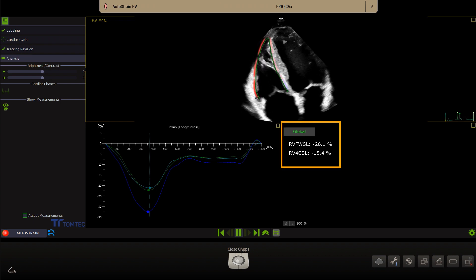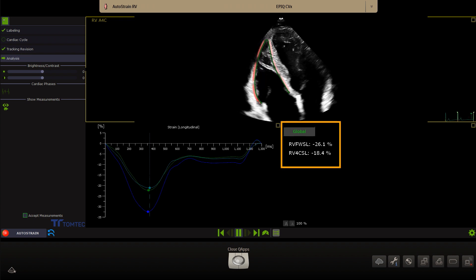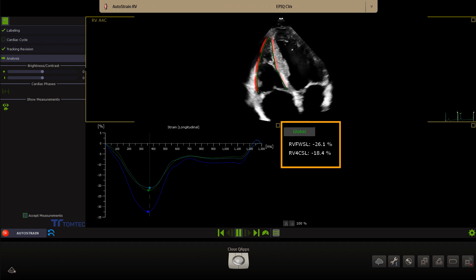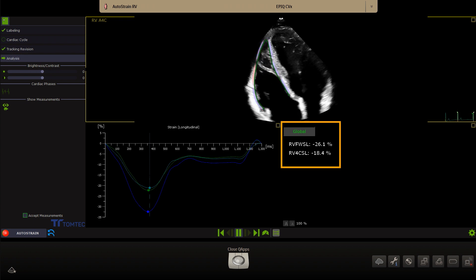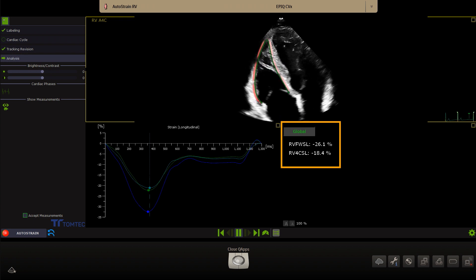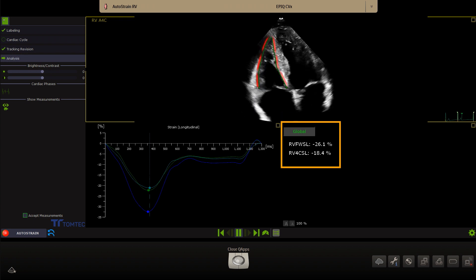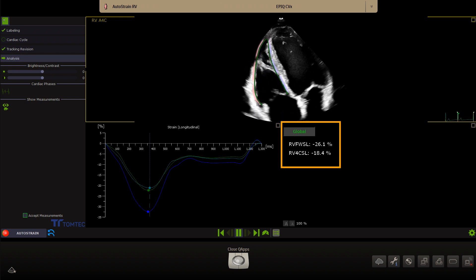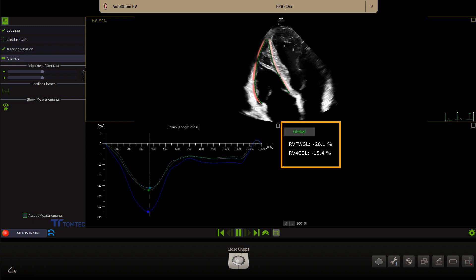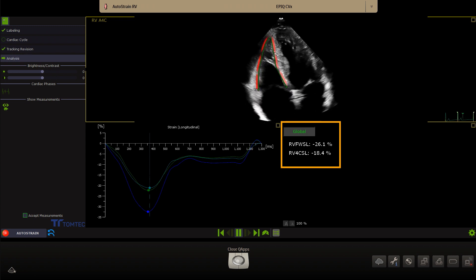The curve below shows the longitudinal strain over time of the three segments of the right ventricle free wall. On the right side, the longitudinal strain value for the right ventricle free wall and a global longitudinal strain value of the right ventricle based on an RV-focused 4-chamber view is displayed.